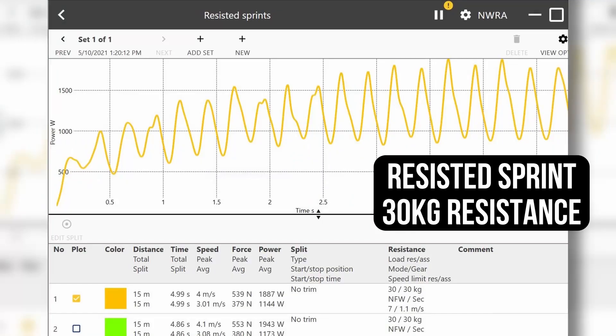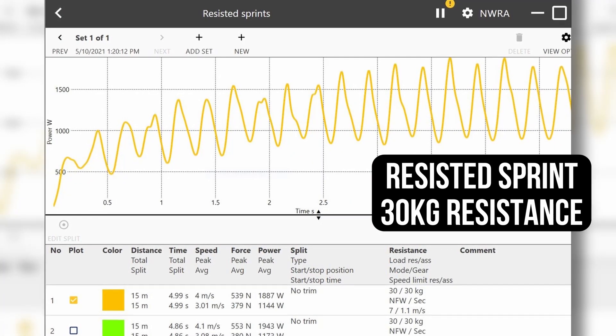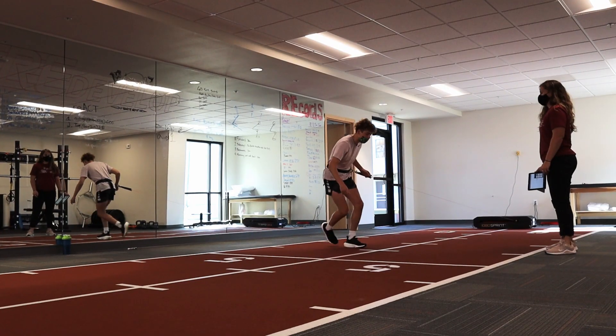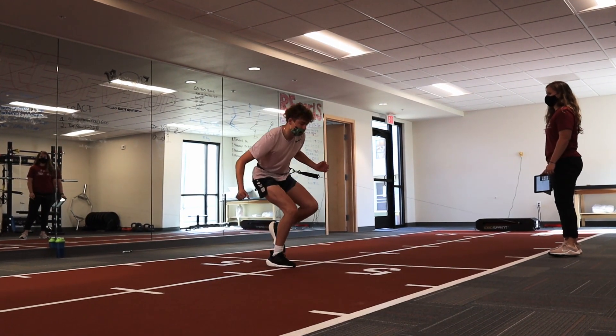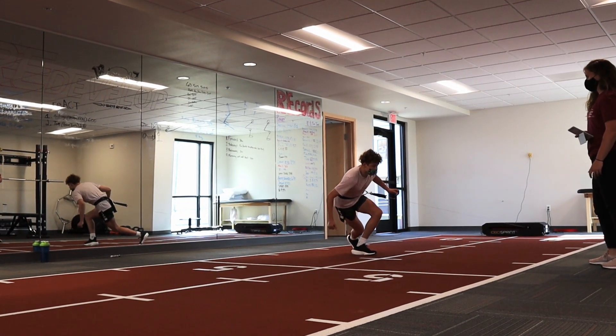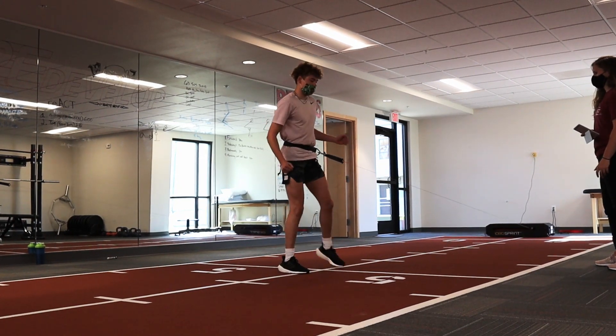After doing these resistance sprints for every individual person, we can calculate what kind of resistance we need them running against and train them at the resistance that's going to be optimal for their power production and speed. The 1080 allows us to load and overload an athlete so that we're giving them that stimulus they're going to experience in a game-type environment. That helps us get them ready, but I also think that's a huge mental boost for them as well.